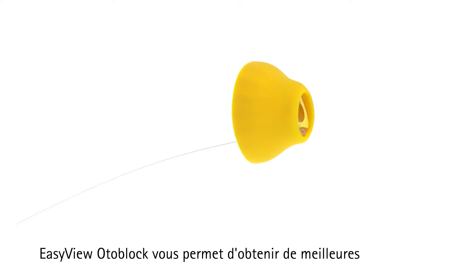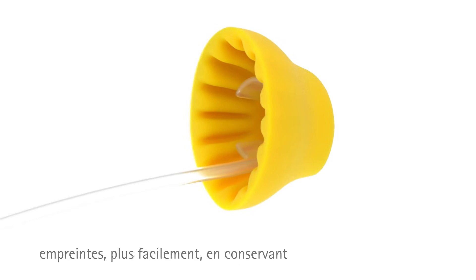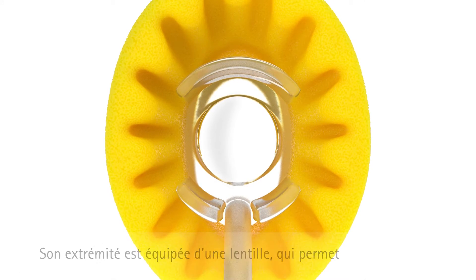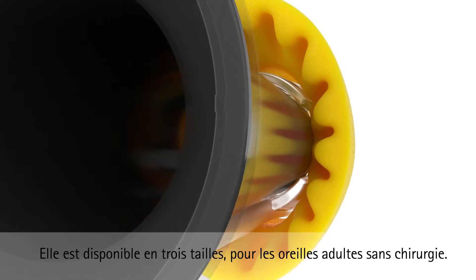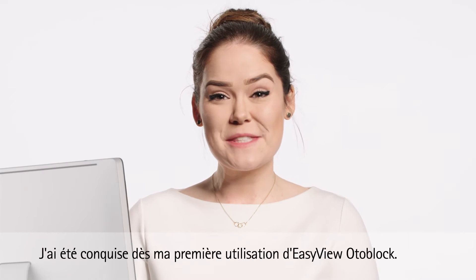The EasyView Otoblock allows you to get better and easier impressions while using all of your standard impression equipment. It has a lens at the end to allow full visualization during insertion and slides right onto the end of your own specula. It comes in three sizes for adult non-surgical ears.